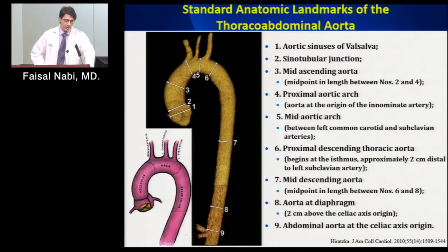So some of the things I'll definitely be covering overlap with what Dr. Q was mentioning. There have been a lot of recent guidelines for the imagers and the vascular surgeons on what a good CT report should encompass. And this is one of the tables in those manuscripts, which really describes, if you are going to evaluate the aorta, where specific measurements need to be made for the structures you're following.